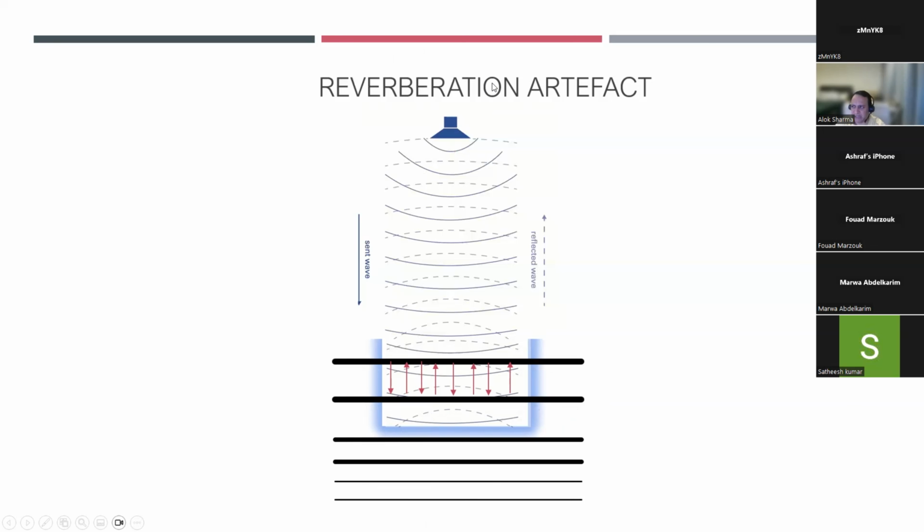Does that make sense? So yes, the ones above, obviously, you can say, I understand it's the pleura, but as it goes down deeper, the tissue content has to be... No, that's not tissue, that's artifact. You're not really seeing them. This is really important. This is artifact. So it's not as if there's tissue there that's causing this.